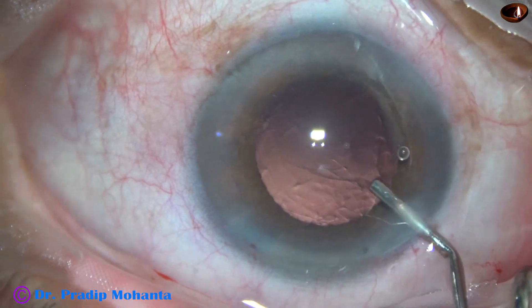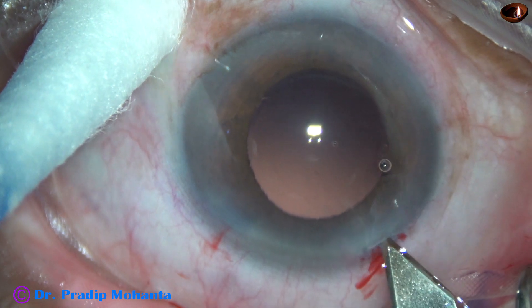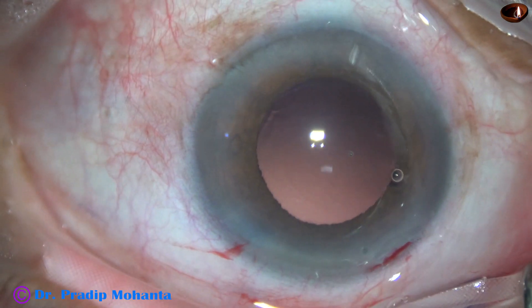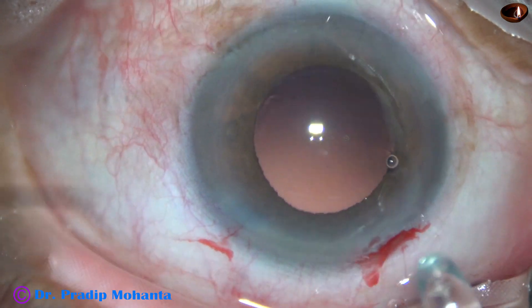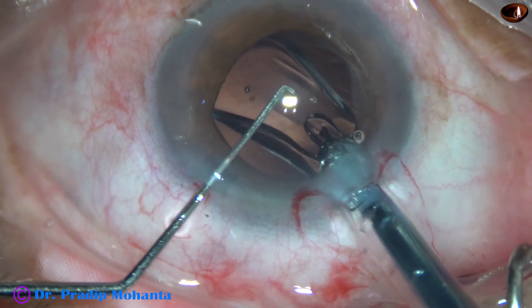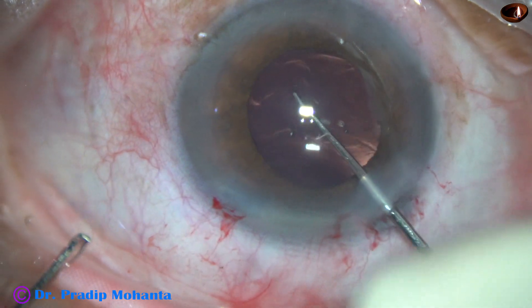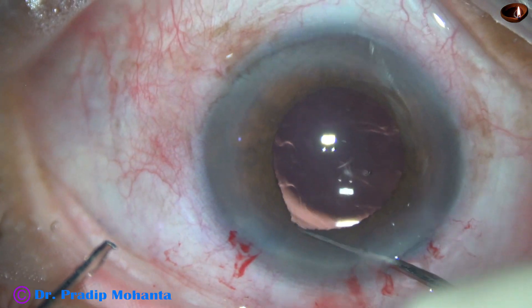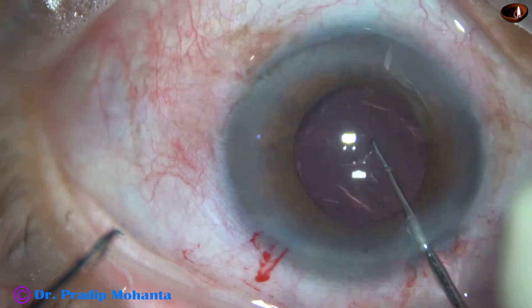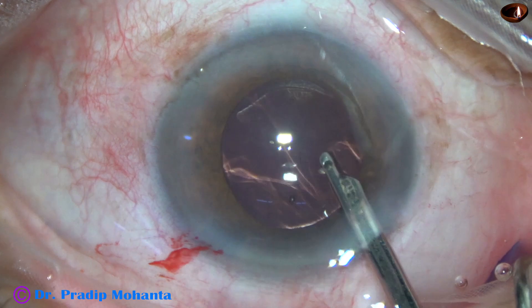And now, implantation of the intraocular lens. I inject viscoelastic and let the pupil dilate — you can see the rhexis margin nicely. I am enlarging the main wound by 0.1 to 0.2 mm to easily implant the intraocular lens. This is a B cartridge; if we use a C cartridge, we need not extend the main wound. The lens goes into the capsular bag, and now I will rotate the lens to go behind it and remove viscoelastic from the capsular bag, to avoid viscoelastic-induced raised IOP in the post-operative period.